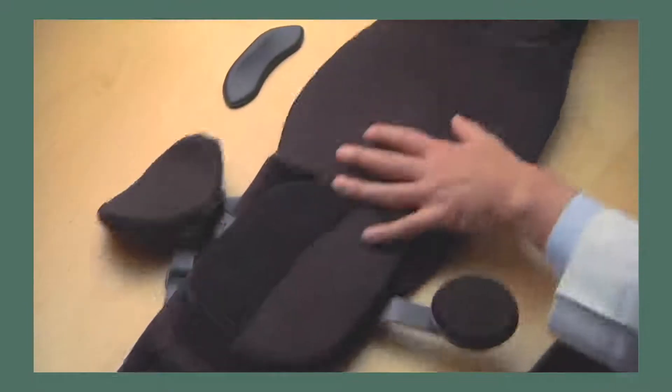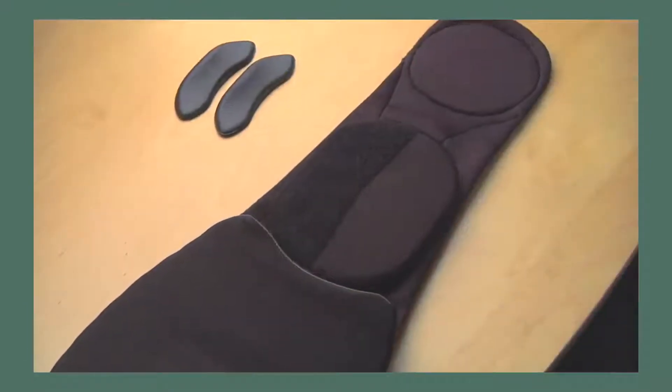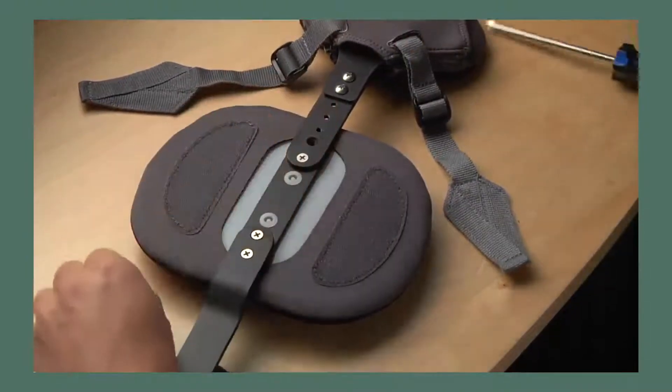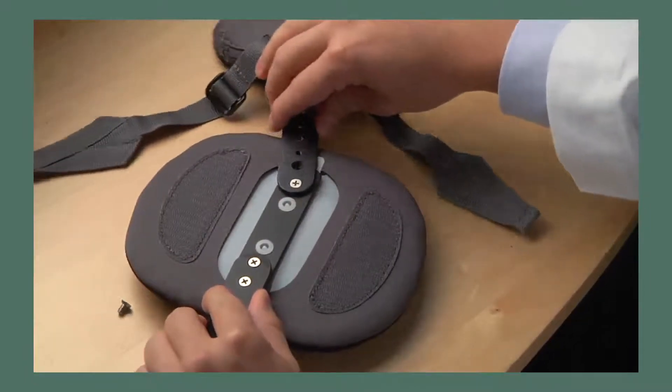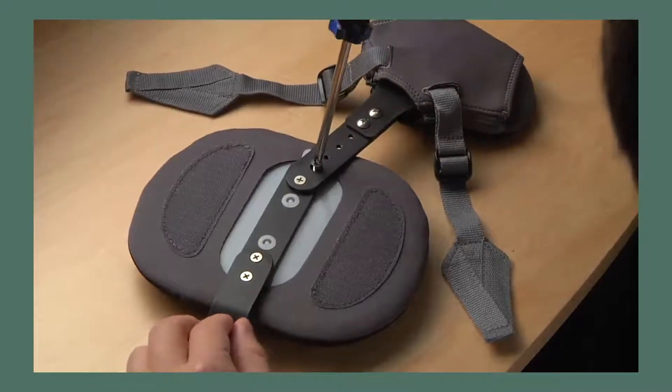If the patient finds the iliac pads to be uncomfortable, they can be removed entirely. For certain patients, it may be desirable to angle the thoracic pad by removing the lock screw, positioning the strut in the desired angle, and reinstalling the screw.